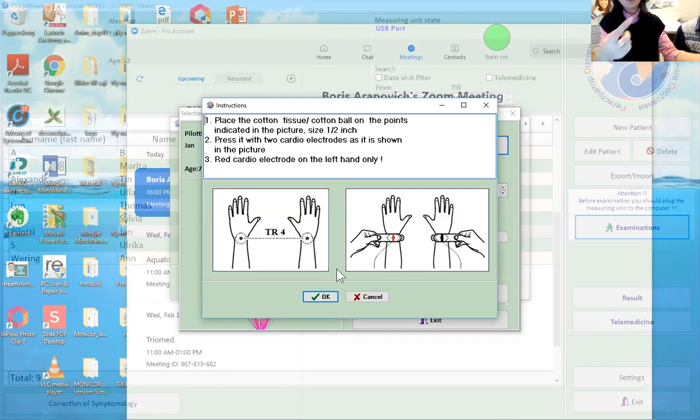It starts to measure this one pill. Then it says to put the other one, so you take that one and put the other one. When you've done, you will see, there are also colors, but maybe we will do it next time, because it's interesting to go through it. Yes, that would be fantastic.